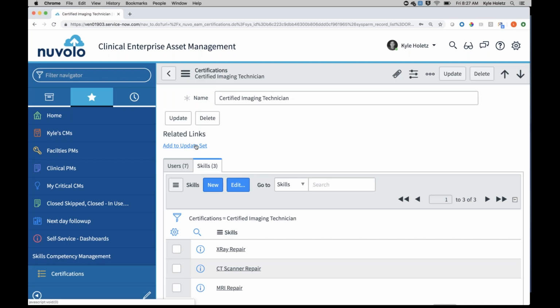Knowing the model of device can allow us to now know who is skilled, who is competent in working on that particular device. We do know that, right? So now we maybe find someone that can troubleshoot that down and figure out what on the bed is broken, right? What specifically. But to your point, on the front end, we need to be giving the person that says "any broken" a common list of things that they should be asking. Is it this, this, and this? Those common symptoms that allow that engineer to ultimately narrow down.